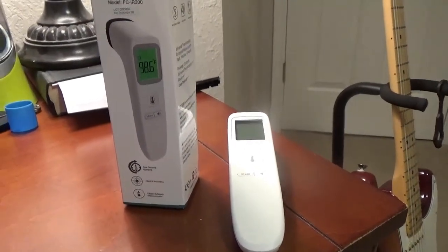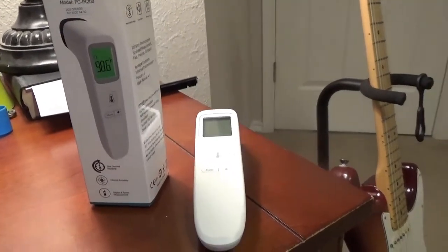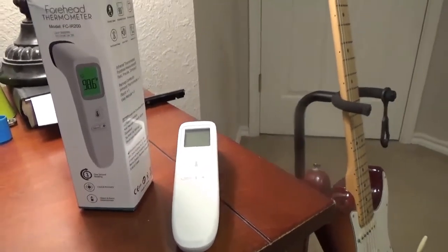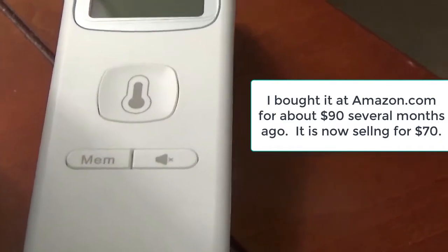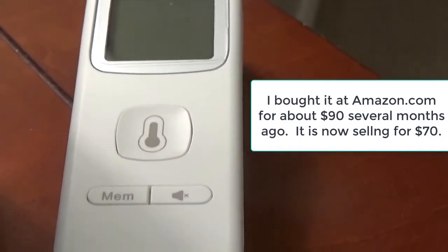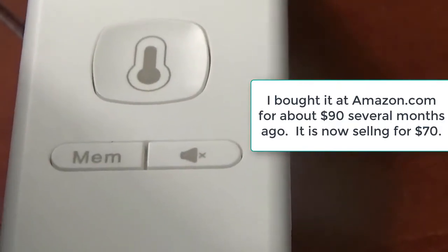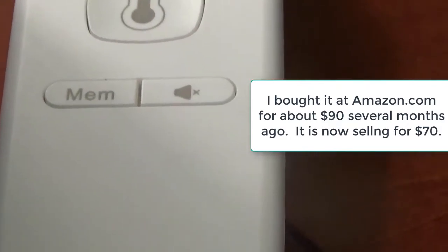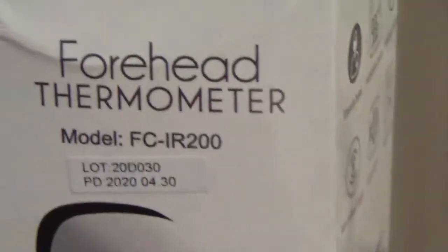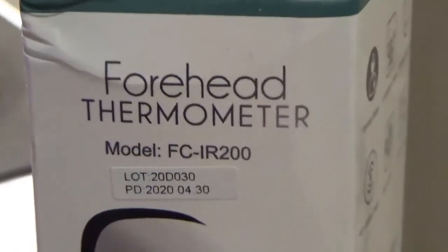This will be a short review of a non-contact infrared thermometer that I bought on Amazon. I bought it for $90 — a bit overpriced — but at the time I needed it. It's now selling for $70, and as I'm talking you can look at the specs here.